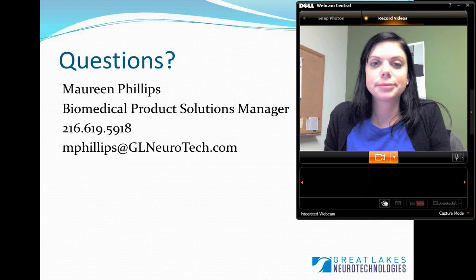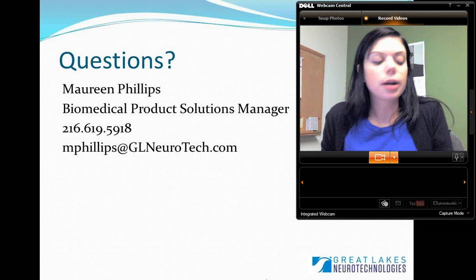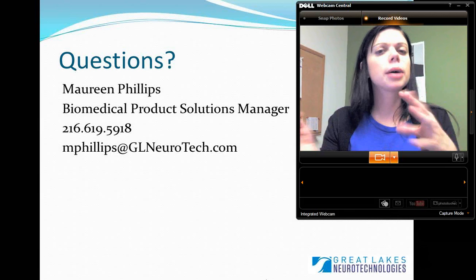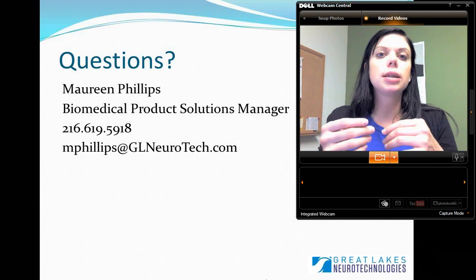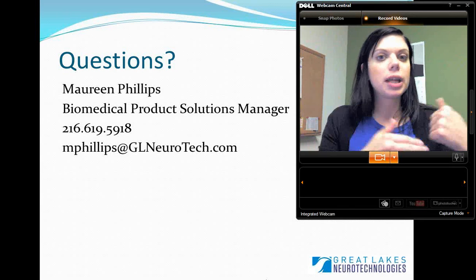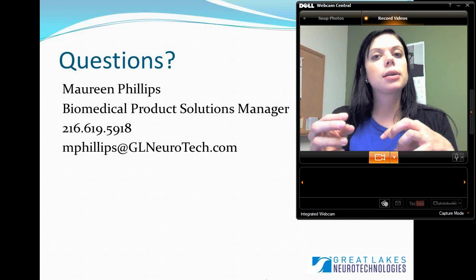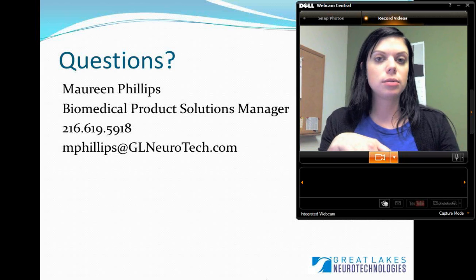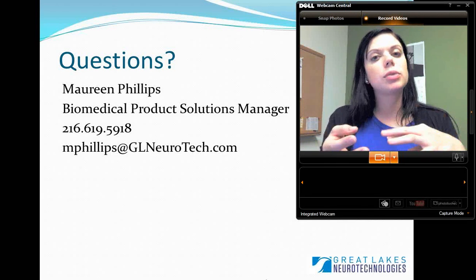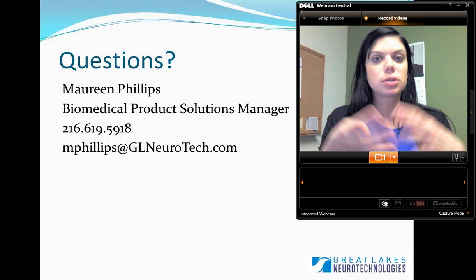First question, are the 8 input channels on the BioRadio limited to 8 electrodes on an EEG cap? Yes, they are. So since the inputs or the channels for EEG are single-ended inputs, and there are 8 channels on the BioRadio, you are limited to the 8 inputs. That does not include your ground or your reference that might go on the mastoid. We already have one ground channel that's referenced to all of those 8. However, you can combine multiple BioRadios if you needed to record 16 or 32 channels, a higher number.